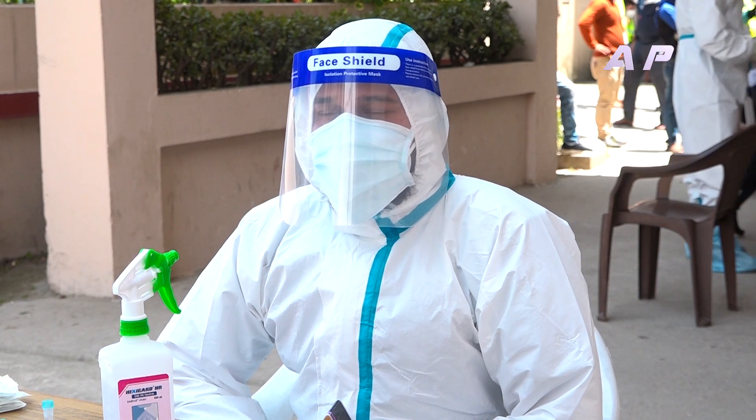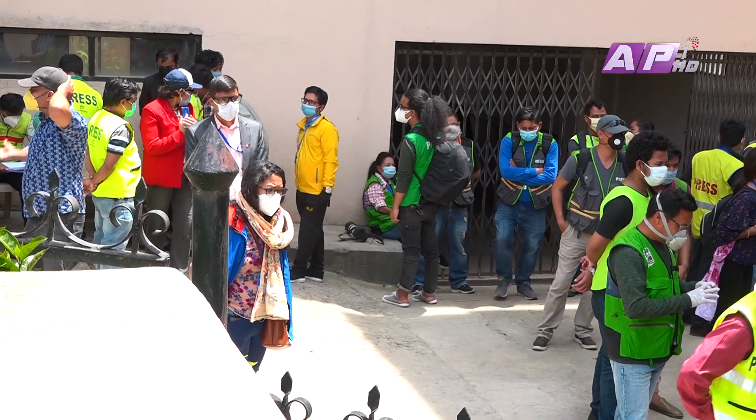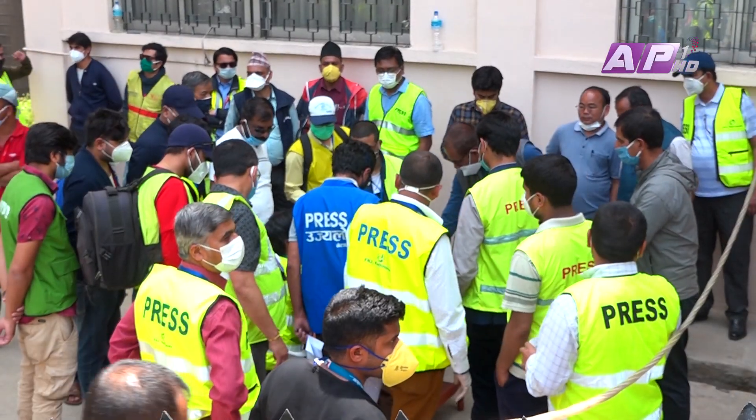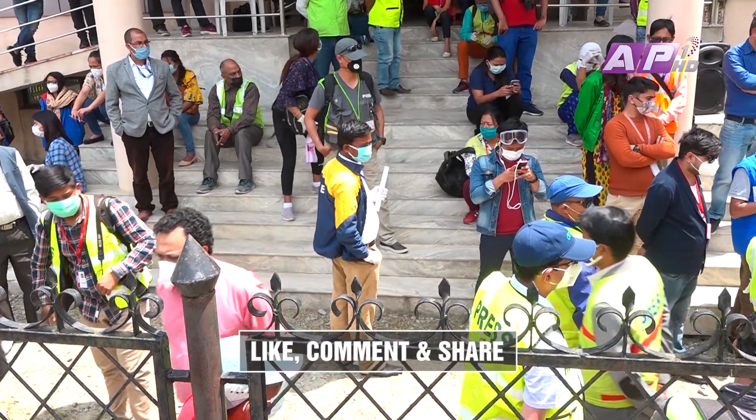Now we have the sample from the field transported to NPHL, which is the best way to test it. Let us know how to test it. Welcome to the GMA, which has a lot of experience.